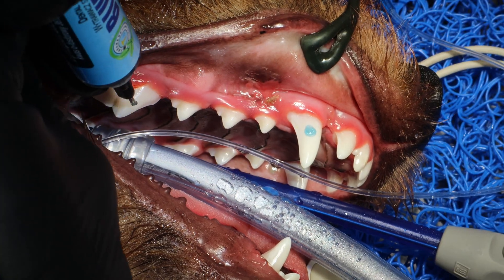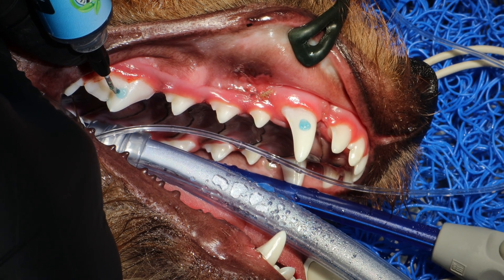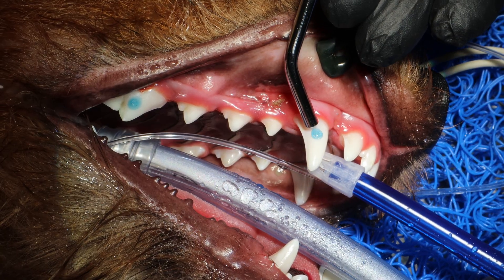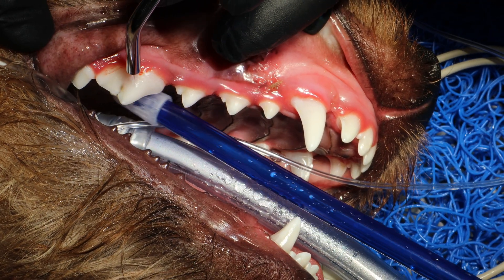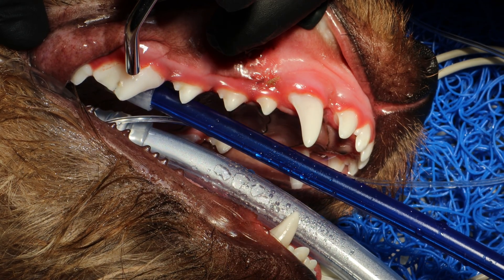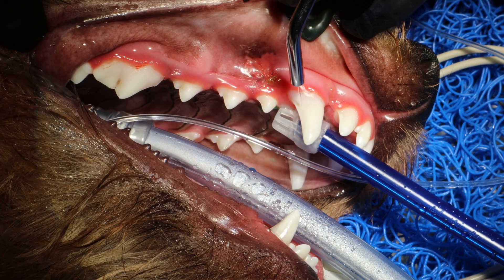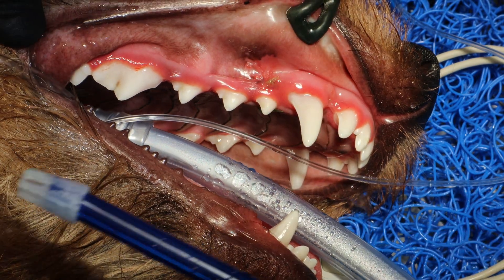Here I'm applying 37% phosphoric acid on the enamel. This needs to stay there for about 20 seconds. What it does is create almost like a velcro surface with lots of small spikes that will make the surface more adherent to the bonding material. It's just a preparation to make sure our buttons will stick to the tooth and not fall off. If you etch for 20 seconds, you should flush for about 20 seconds too, to avoid any sensitivity issues with remnants of the acid migrating into the tooth tubules.